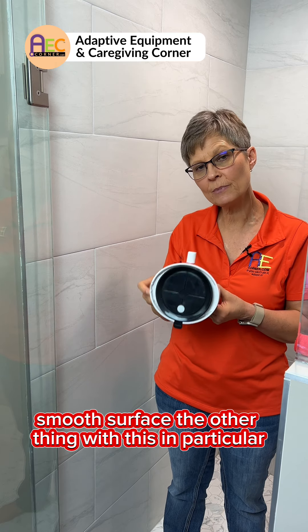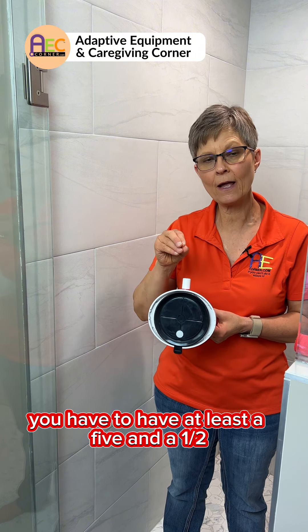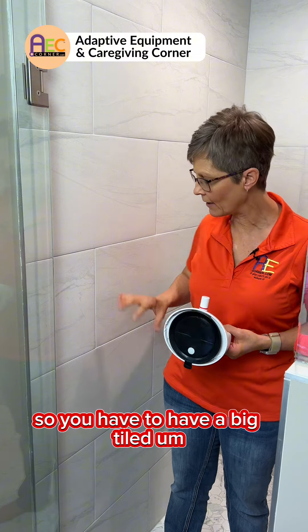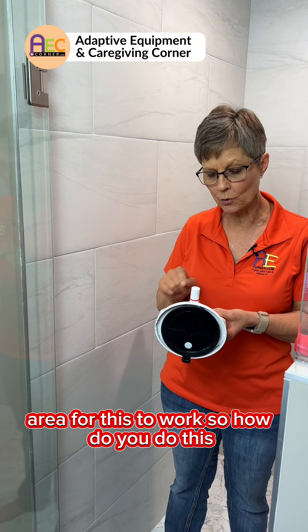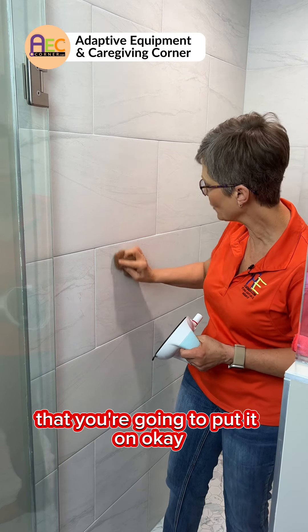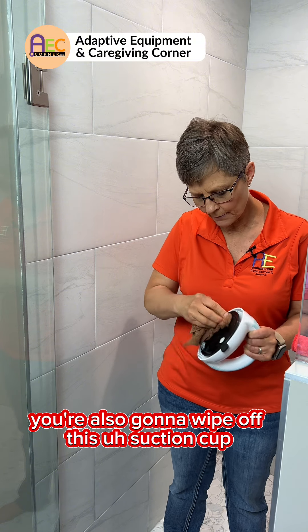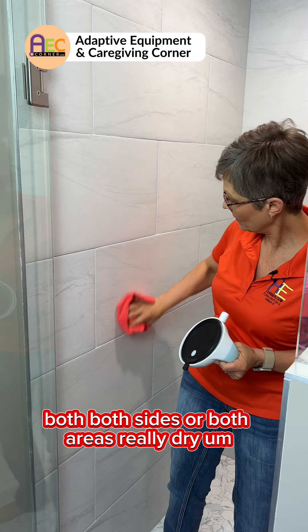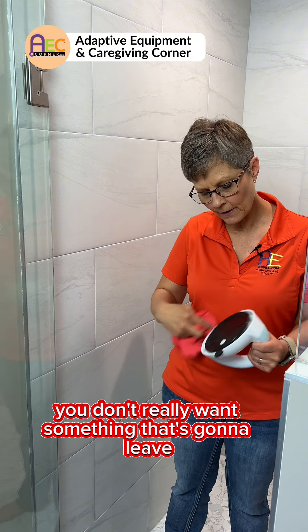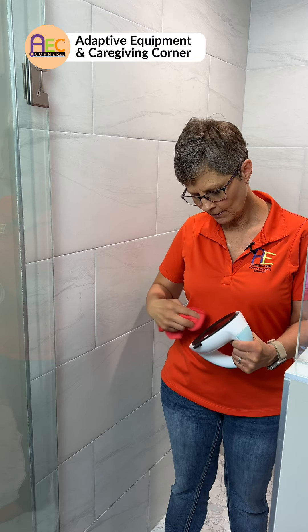Smooth surface. Also, because of the size of this suction cup, you have to have at least a five and a half by five and a half square area where you don't hit grout or anything like that — so you need a big tiled area for this to work. You're going to take a damp cloth, wipe off the area you're going to put it on, and also wipe off the suction cup. You want both areas really dry and clean so that it is going to hold.